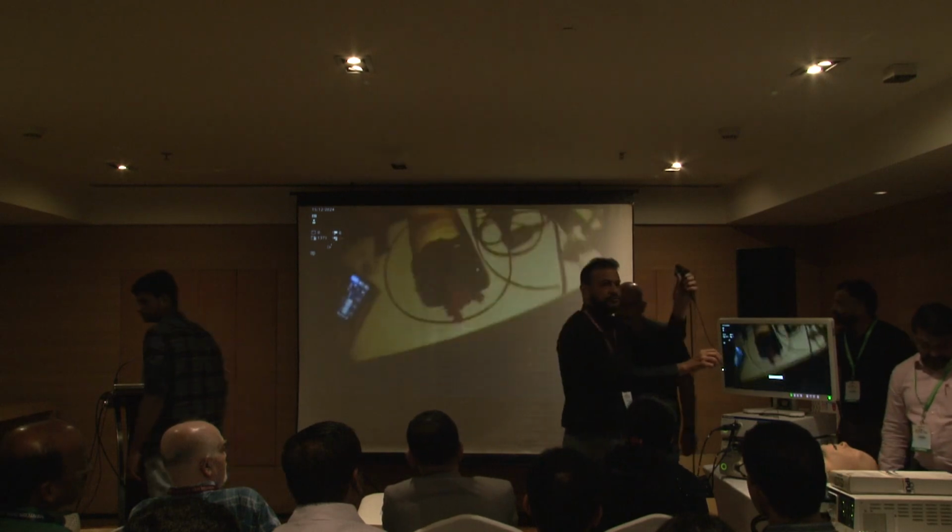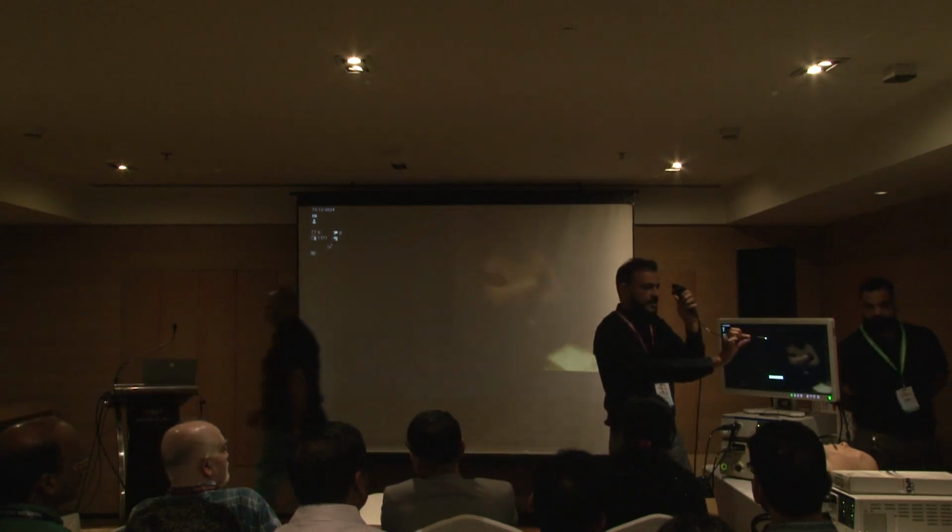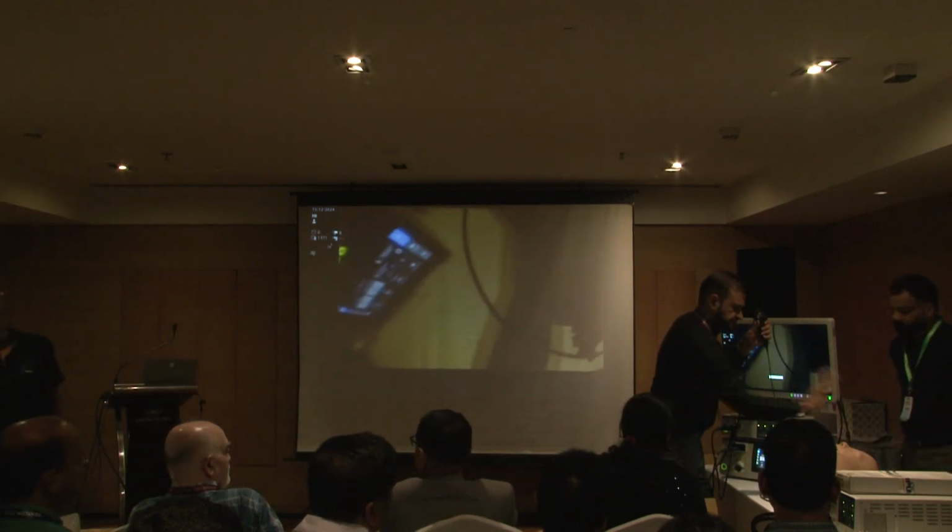One important point when we are doing a flexible scopy.